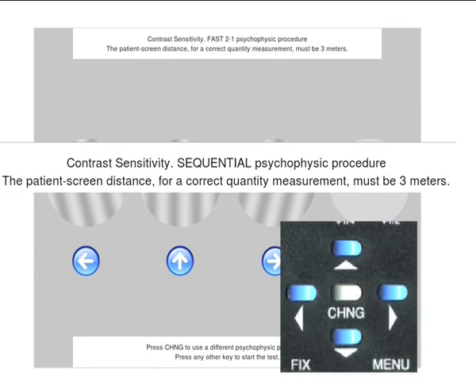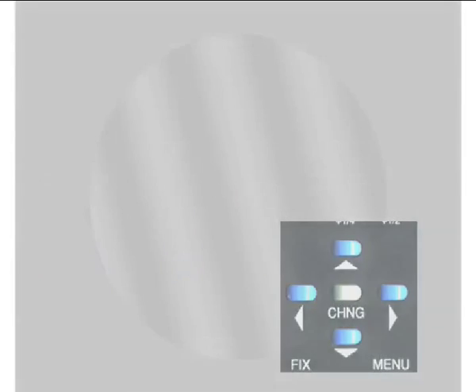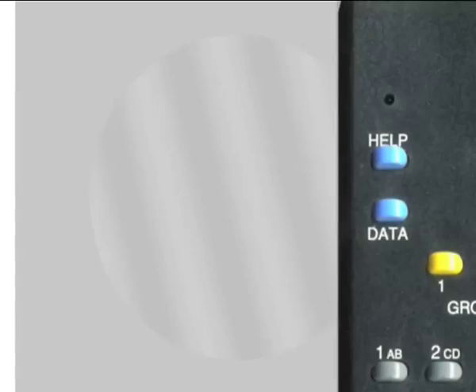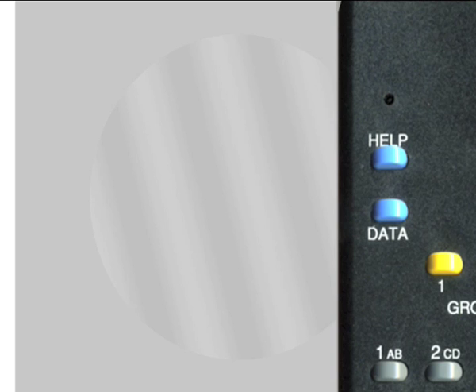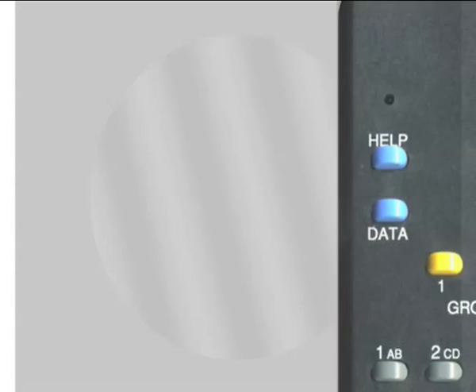Press a cursor key to start the test. The data related to the displayed stimulus are initially hidden, but if you press the data key, they will appear on the screen.